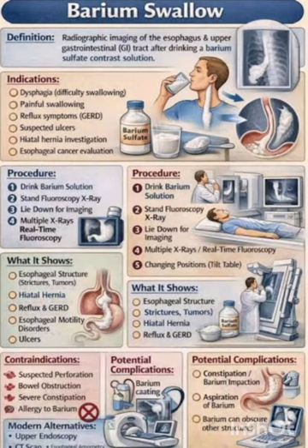Why is barium sulfate used as a contrast agent? First, it absorbs X-rays and appears white on radiographs, clearly outlining the GI tract. It is not absorbed by the body. It does not react with body tissues under normal conditions. It helps to visualize the lining of the stomach, esophagus, and intestine.